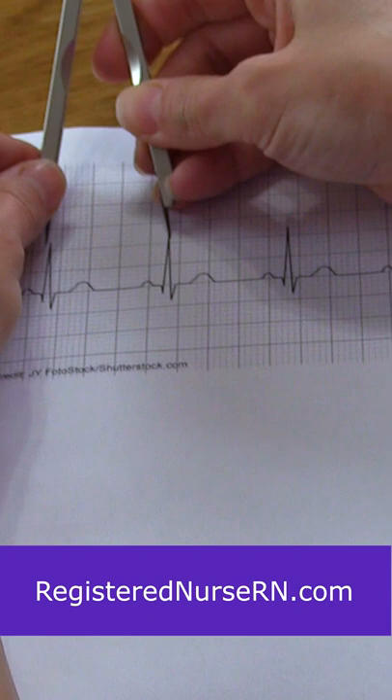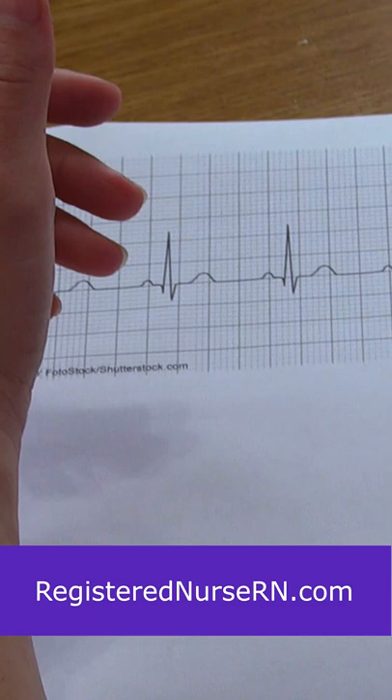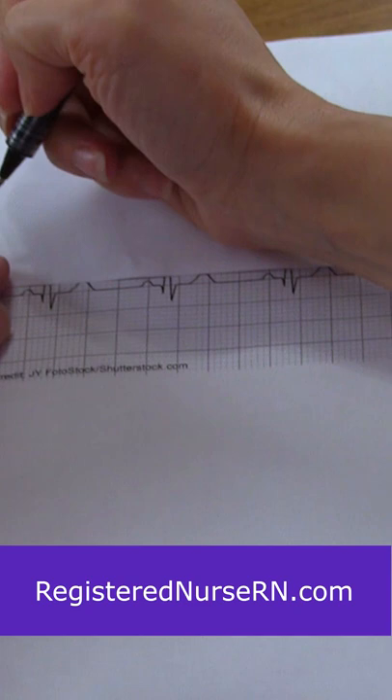It helps you do that, but sometimes you don't always have these. So what can you do? Well, here's a quick little hack to help you out. Get you a piece of paper — so easy to find on the unit. Go right above the P wave and mark it on the piece of paper.